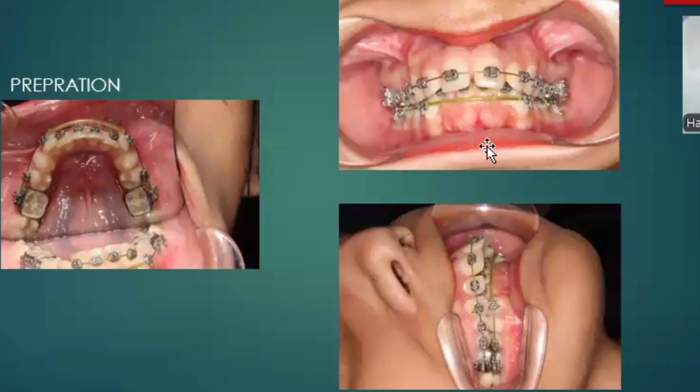This is how we prepare our patient for intrusion arch. Incisors aligned in a separate segment, right and left posterior segments, bypassing the incisors with one continuous arch, having an archwire sleeve so that it does not disturb the patient. When we reach the rectangular wire 1725 or 1925, our patient is ready for intrusion.